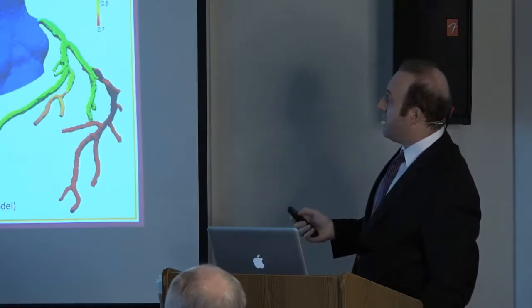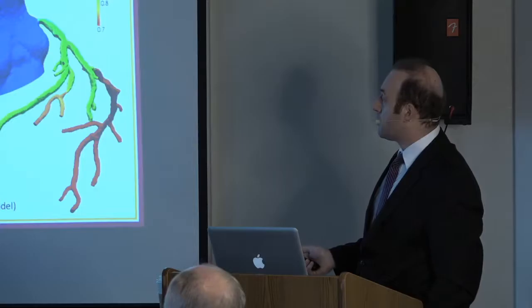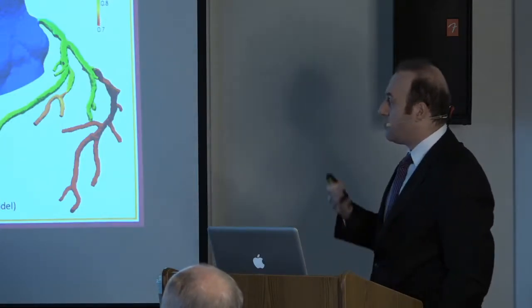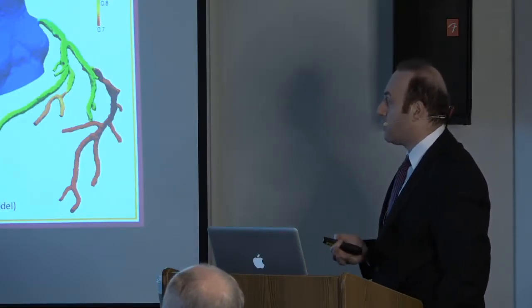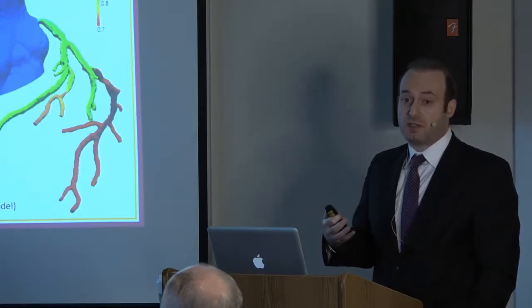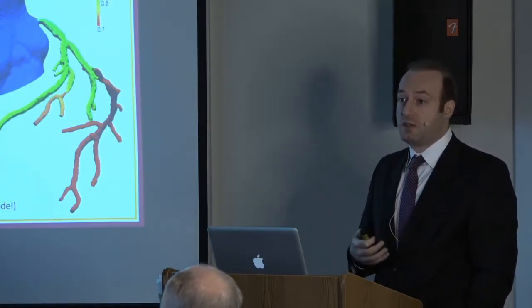Okay, and FFR CT is derived from a standard, typical coronary CT angiogram. There's no additional radiation to the patient. There's no change in the imaging protocol, and there's no additional medications that need to be administered to the patient. So it's all derived from the raw data of a static coronary CT angiogram.